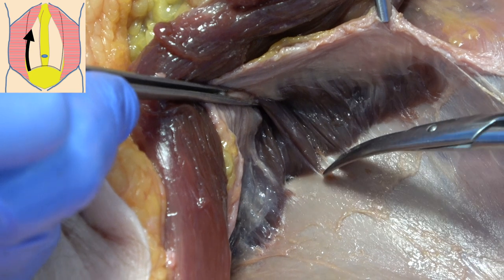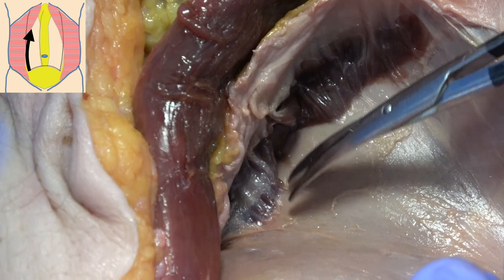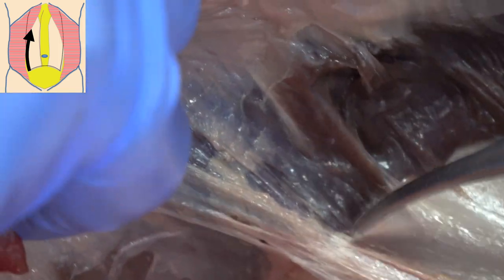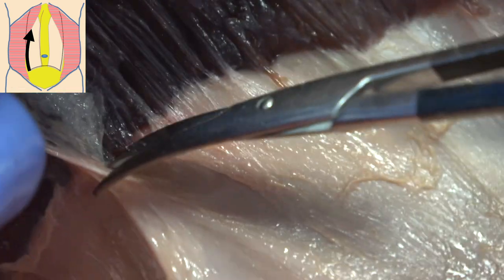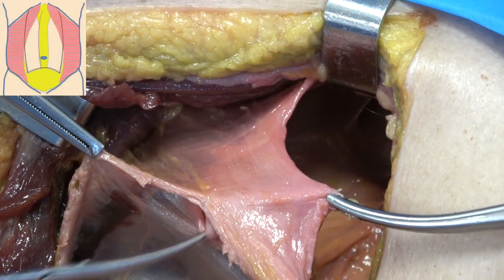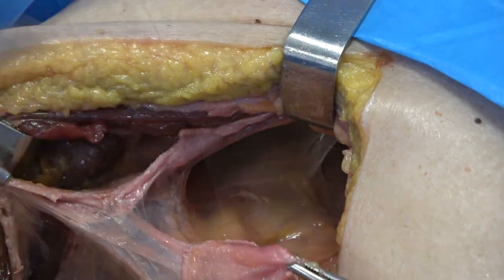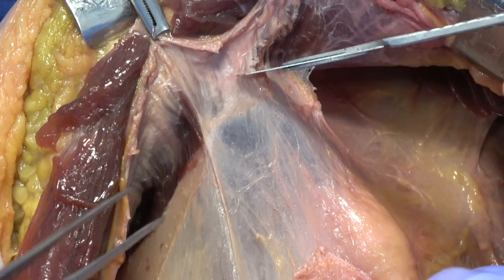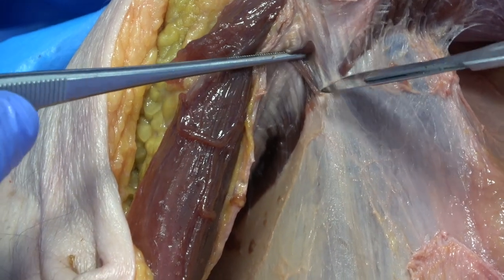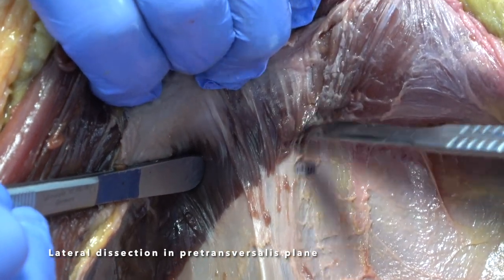In the superior part of the abdomen we advocate performing the lateral extension in a pre-transversalis plane, as the peritoneum is not protected here by the periperitoneal fat distribution. We are now communicating the lateral incision on the posterior rectus sheath with the medial incision made at the beginning. As we have performed the periperitoneal pre-transversalis dissection in the epigastric area, we enable the detachment of the peritoneum from the posterior rectus sheath despite tears that could potentially be made at this more difficult area.